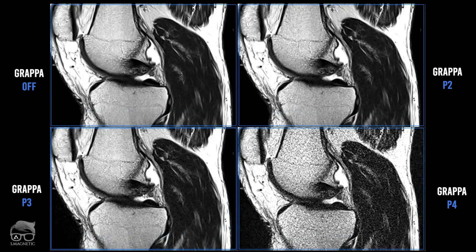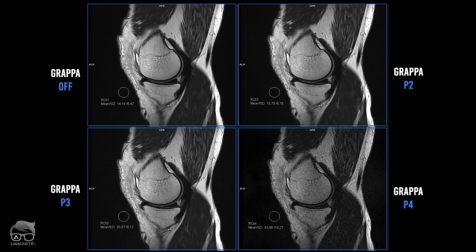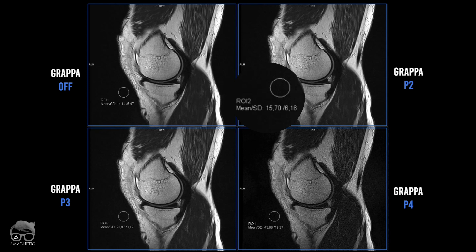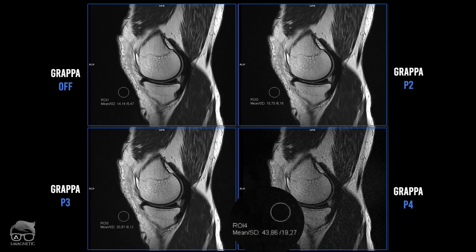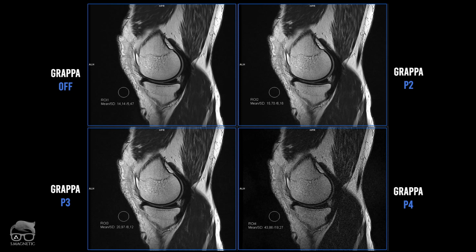Let's do some measurements. I placed a region of interest in the air to check the noise level. The mean for PAT OFF is 14, and PAT2 is 15.7 — not much difference. PAT3 is almost 21, and PAT4 is almost 44, which is clearly visible in the images. Keep in mind that parallel imaging works differently from scanner to scanner and coil to coil depending on your parameter settings. The main point is to understand your case, check image quality, and know how far you can push your parallel imaging.